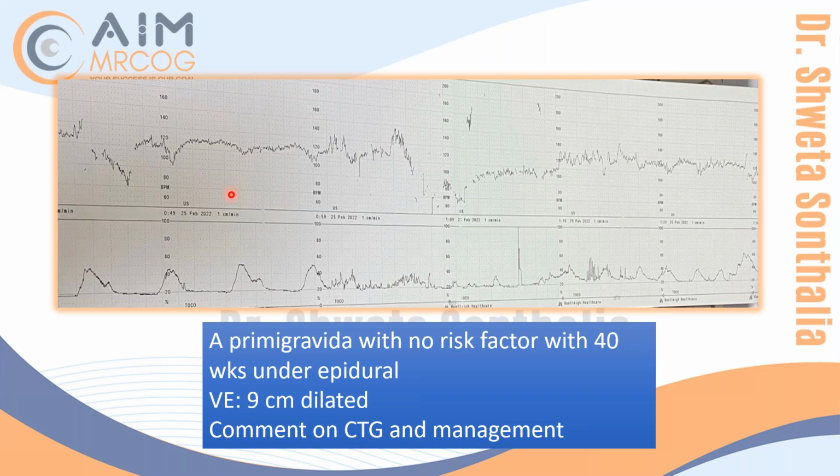Initially there was no acceleration, but at the end there is. This one you mean? Yeah, this one and before this one, 10 minutes. After improving this, there are some accelerations. Okay, and what about deceleration?